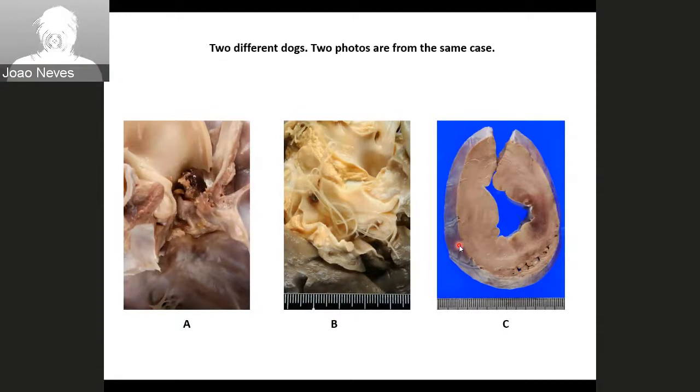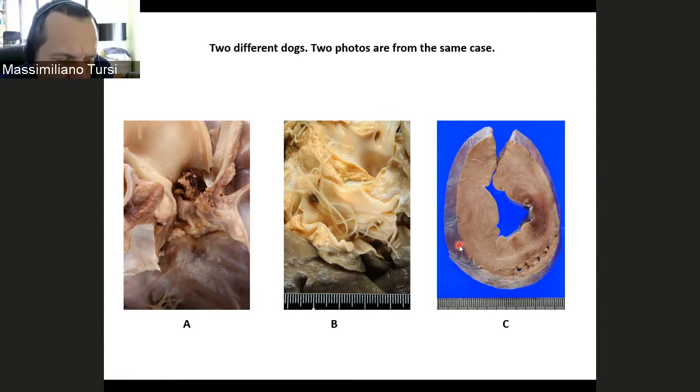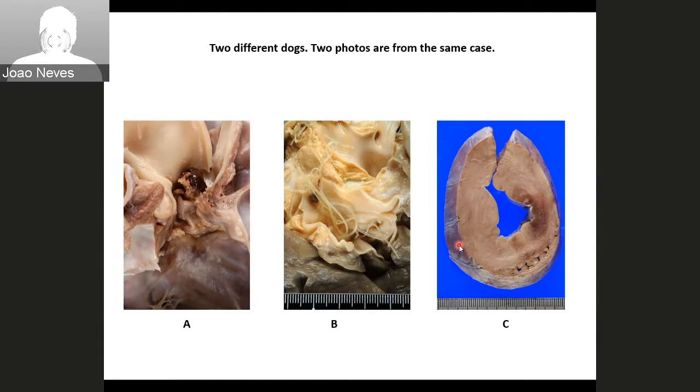Massimiliano, can I just double check something on the image of B? Can we say for sure from this image which artery it is, or can we just assume that it's a pulmonary artery because it's quite close to or surrounding the lungs, but we cannot say which one it is? Is that correct? Because I can't see the correct anatomy of the pulmonary artery. Okay, perfect.